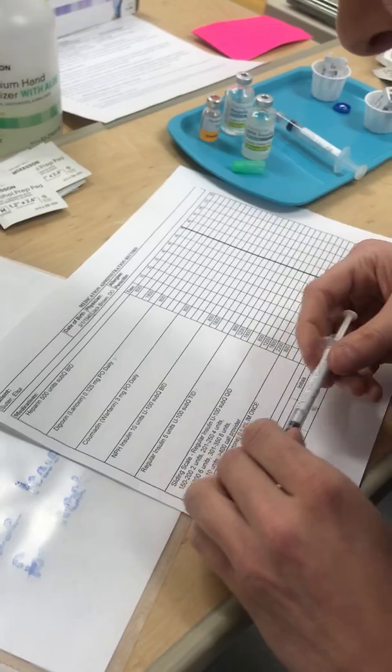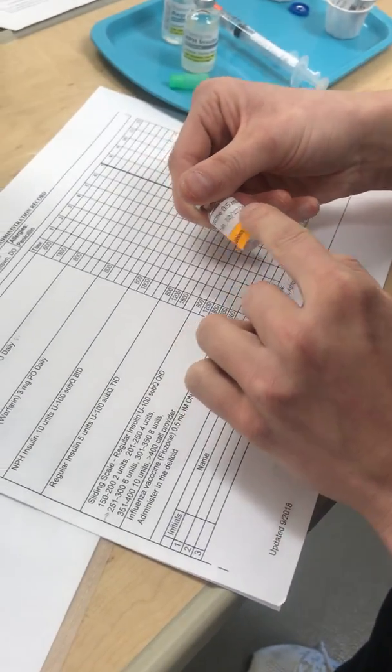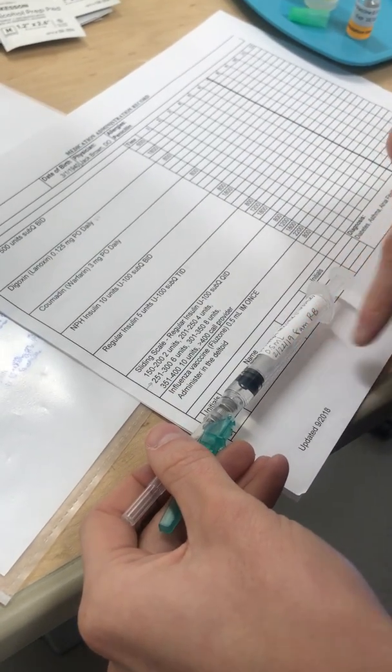And then we'll do our flu zone here, 0.5 IM once, administered in the deltoid, flu zone 0.5 dose, 10/10/25, that looks good. And then we'll just match this up, flu zone 0.5, we got the date, time, no bubbles, that is correct. So I just did my second safety check here.